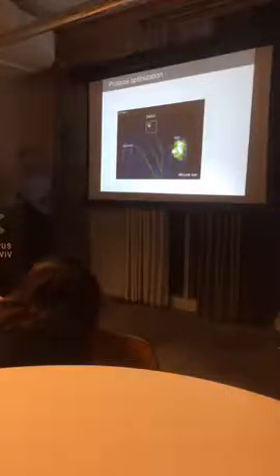This is a fluorescent image. All images are taken with a simple camera with fluorescence. After some time, we see the extravasation of the fluorescent drug at the methyl salicylate, and also a little bit in DMSO. So we can quantify it. How do we quantify? We measure intensity.